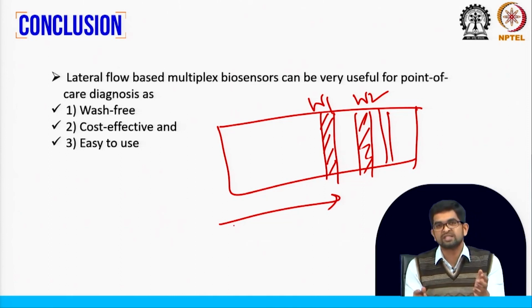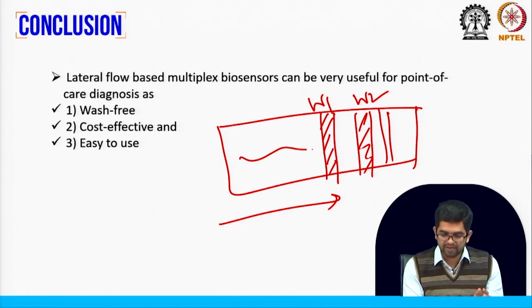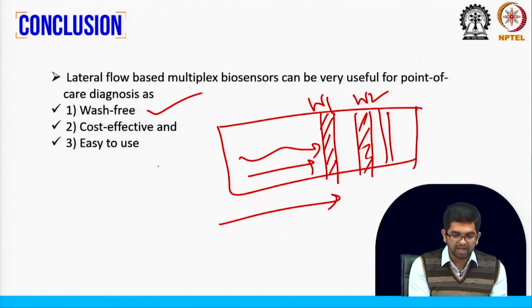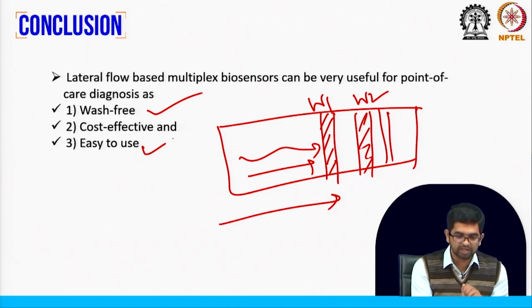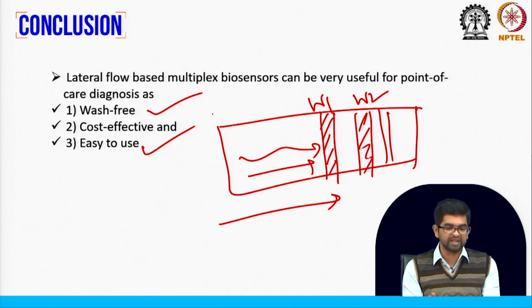This is fully wash free because you do not need extra washing steps; you are not doing it manually. The washing is actually happening inside because of the lateral flow, which helps wash out all the excess reagents. So it is wash free and cost effective, made of paper, and very user friendly; you can bring it very near to the patient. This is a bench to bedside application, very useful and easy to use. That is why this technique is very useful for point of care diagnosis.